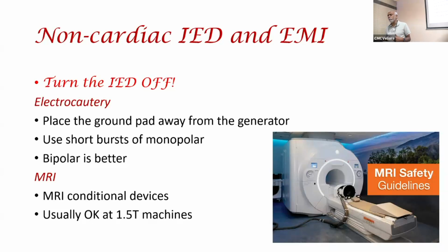MRI, again, these companies are coming out more and more with MRI conditional devices, but it's a problem. Especially if, for example, the one on the brain, it will interfere with your MRI. It will create a big artifact. So those are the problems of this. Actually, we recently had a patient who had a spinal cord stimulator and had some tumor detected on CT, and they had to do an MRI. They had to take the leads out because otherwise you can't do an MRI because you won't see anything there. So that is the problem with this.